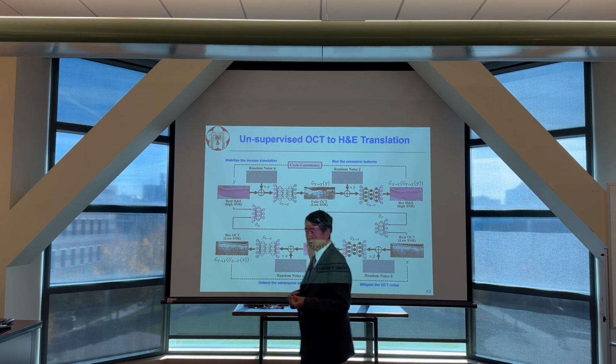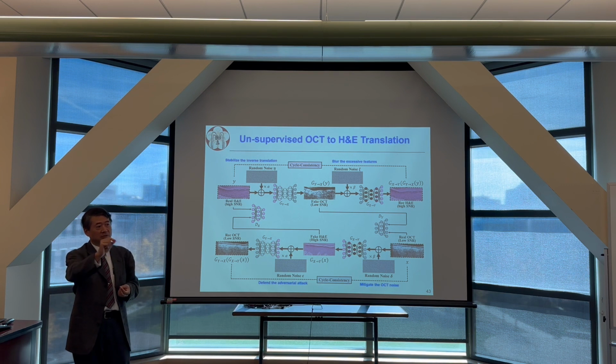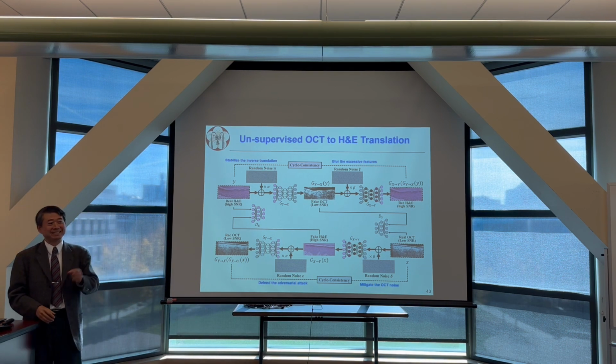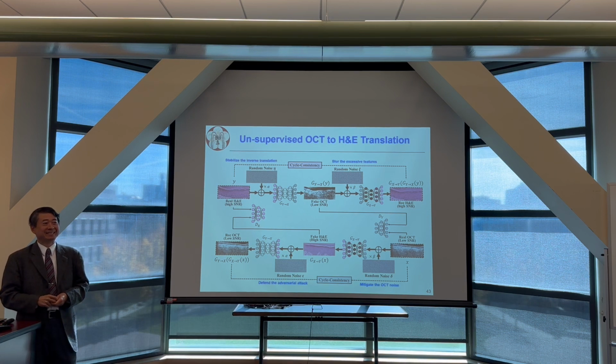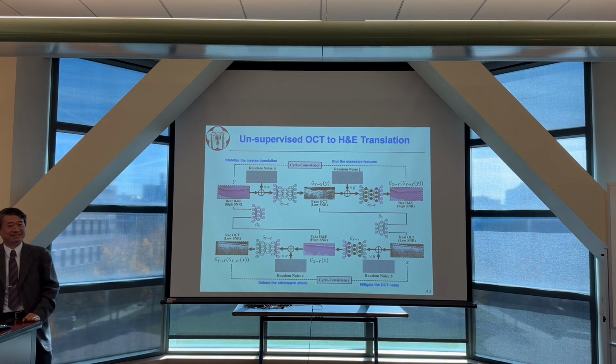Another question you asked is about how costly it is. For the annotation, it really costs a lot of time. So usually right now, in our case, we have a CRA. They help to circle out the segment. Then we give the data to the physician. They double check the result, to have this kind of annotation. Yeah, it really costs a lot of time. That's why I mentioned you got to think about how to reduce the time you need from the physician. It's very important. Especially in Taiwan, all the physicians are very busy, because their salary is linearly proportional to the number of patients they take care of.